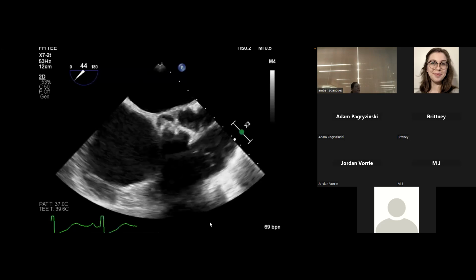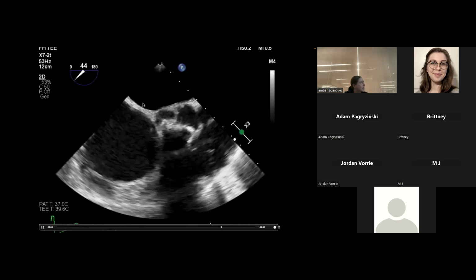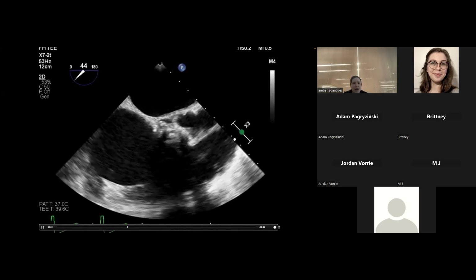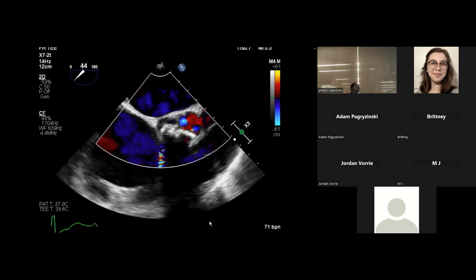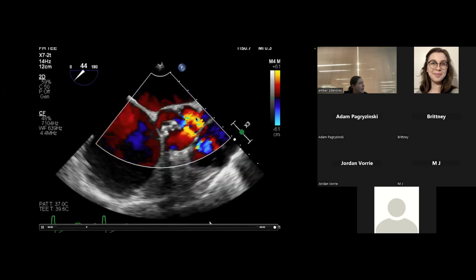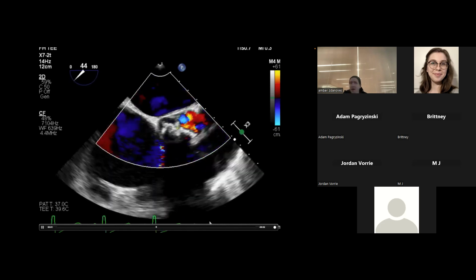And then what do we think? So what view is this? Inflow, outflow, or high aortic valve, or aortic valve short axis. Yeah, because we're a little closer to 30 than the 60. And what do we think about this valve? I think we'd probably like to see it with some color on too. And then what can we sometimes see out here, what vessel can we sometimes see associated with this cusp? One of the coronaries. Okay, what coronary would it be, based on the cusps?